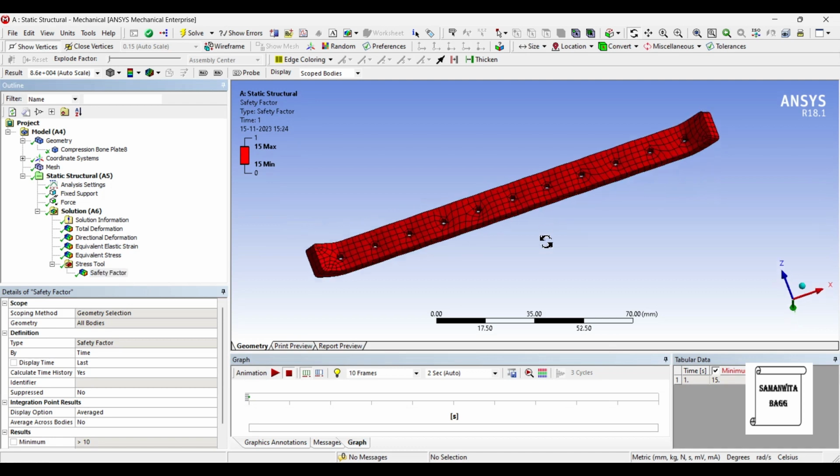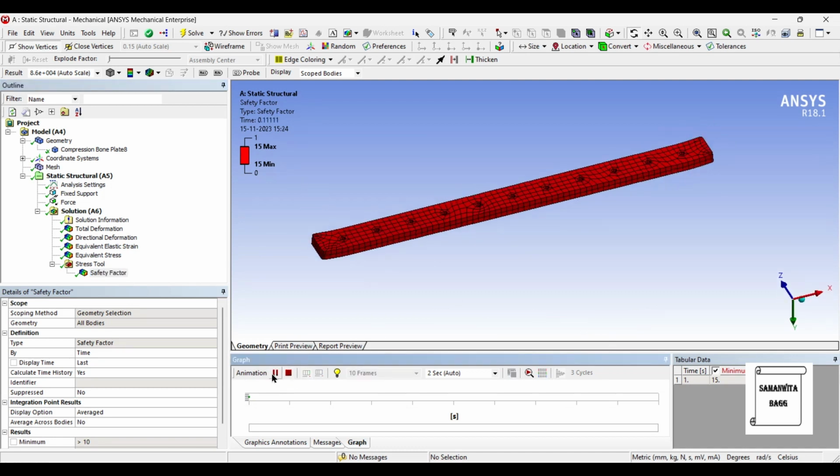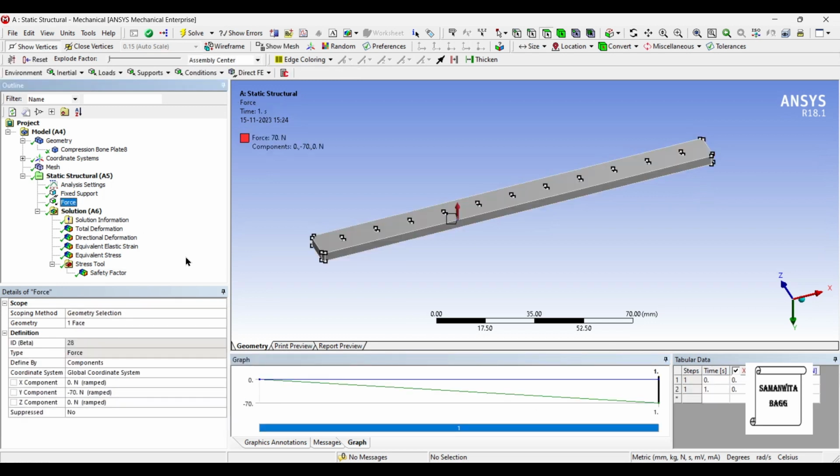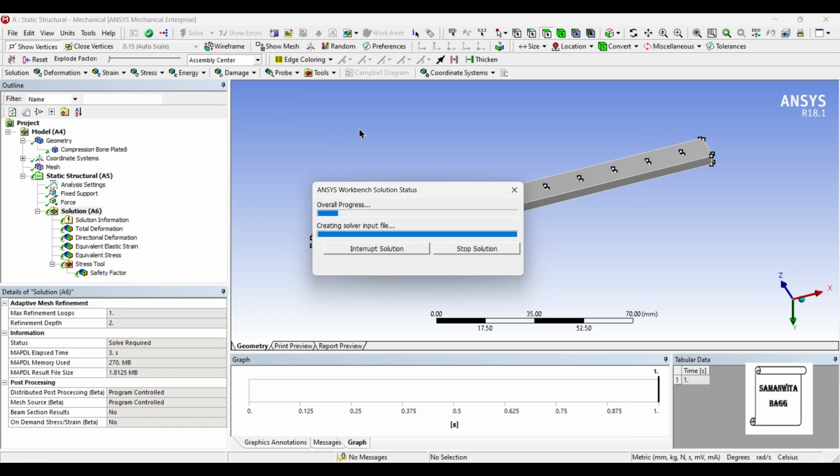Next is the factor of safety. It is showing maximum value of 15, which means our plate is going to be completely safe under this loading. This load that I have applied is actually very less. It is only minus 70 newton, and this is based on the weight of the patient. Now suppose if the patient is of 100 kgs, this will also be minus 100 newton as per the calculation I told you. You can just solve once again and check the result.